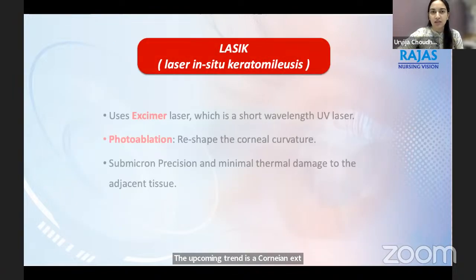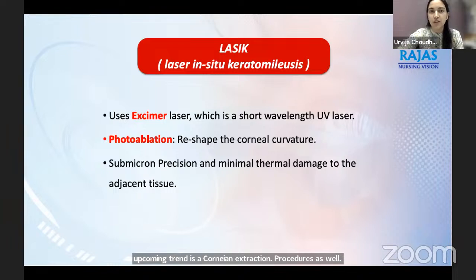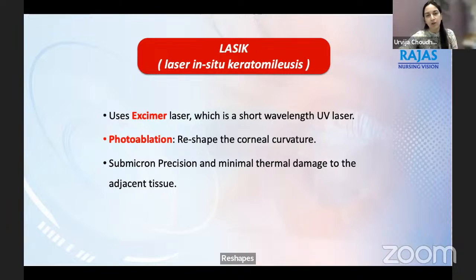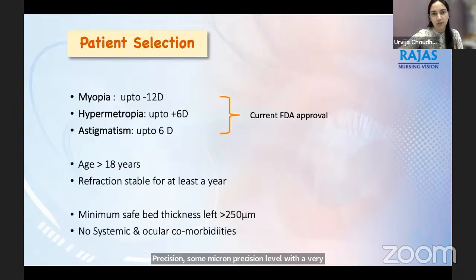The most commonly done surgery is LASIK, which uses an excimer laser with a short wavelength, and it works on the principle of photoablation, where it reshapes your corneal curvature at a sub-micron precision level with very minimal collateral damage to the adjacent tissue.